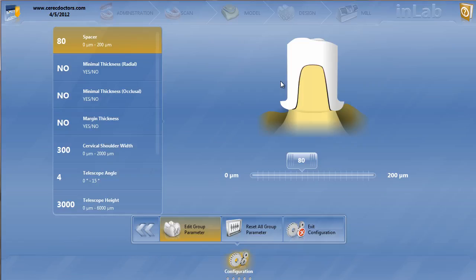Or even you can use that on a 3.0 diameter where there's no 3.0 diameter implant crown or abutments where there's no zirconia alternative. Sometimes I'll just create a telescope over the top of that 3.0 titanium base or stock metal abutment in the anterior.